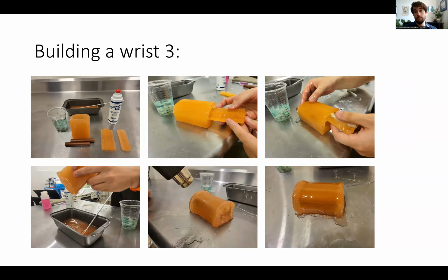Then we got to get a little messy. And this is where I go into the whole making things in your garage, because while I am doing this in the simulation center, this is certainly not what I would call simulation center level cleanliness. And this is certainly not a highly robust and well thought out procedure. I'm just taking these pieces, getting my hands covered in ultrasound jelly, which is just there to cause lubrication, and sticking it all together, sealing the sides by dunking it back into the hot ballistics gel, and heat gunning it to melt everything together.